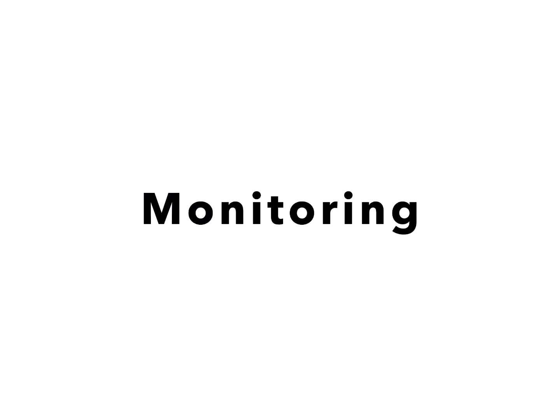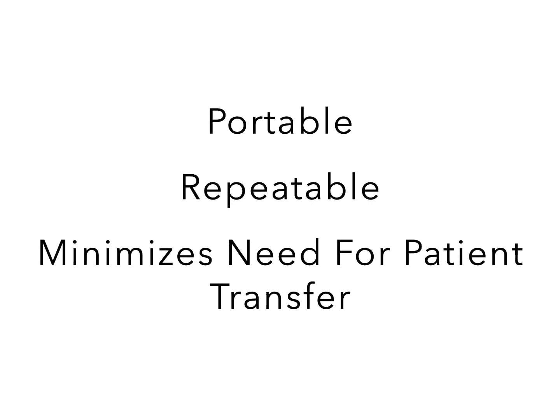Lastly, let's talk about monitoring. This is probably where lung ultrasound will be most helpful. It's portable, can be performed at the bedside, it's repeatable, and it minimizes the need for transferring the patient.